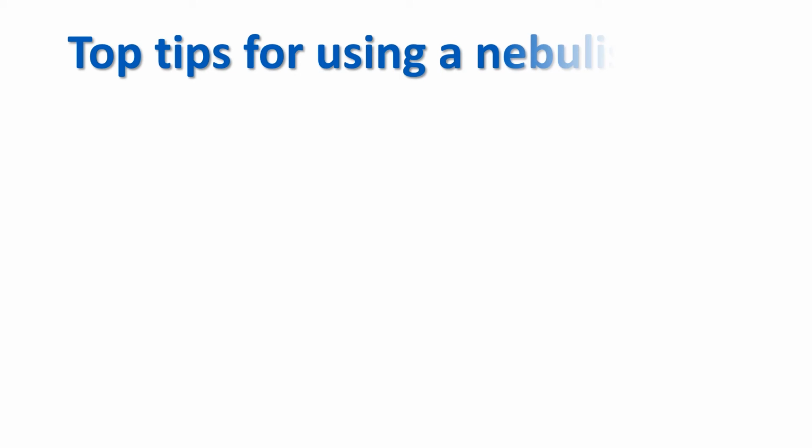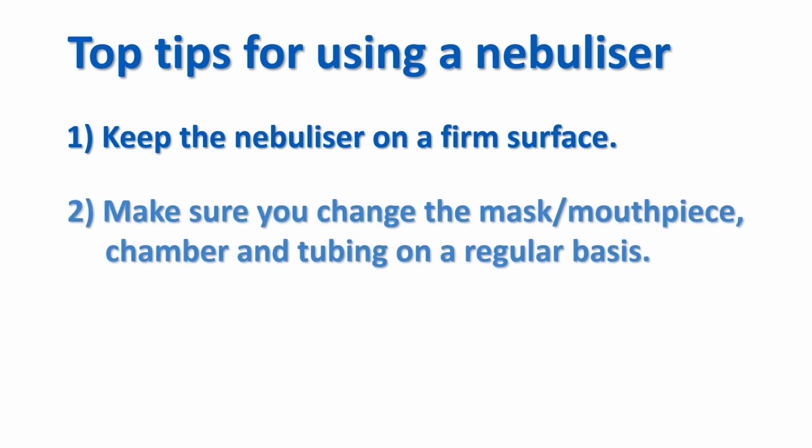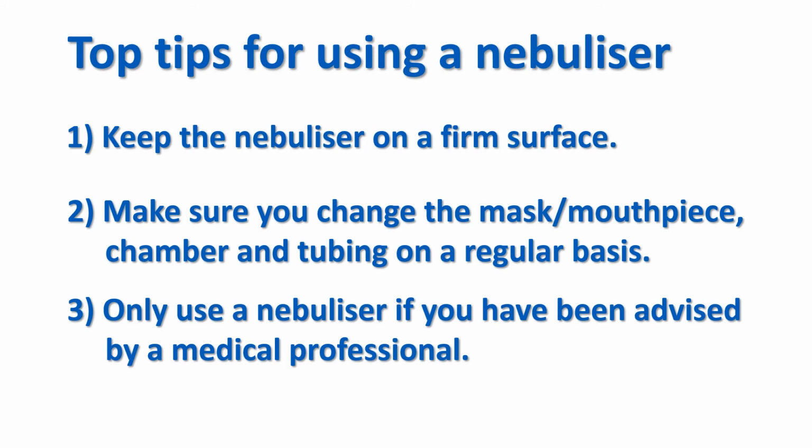Top tips, and please remember, keep the compressor and neb machine on a firm surface. If kept on a carpet or floor, dust particles could be drawn into the machine. Parts such as mouthpiece, mask, tubing, chamber need to be changed regularly, at least every 3 to 4 months or following each infective exacerbation. Only use a nebuliser if you've been advised by a medical professional. If you have any questions or queries, please contact the team for advice.